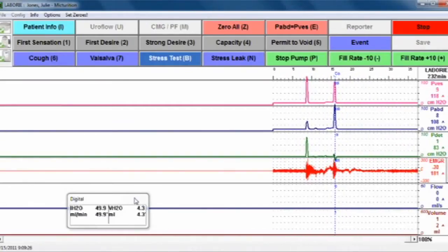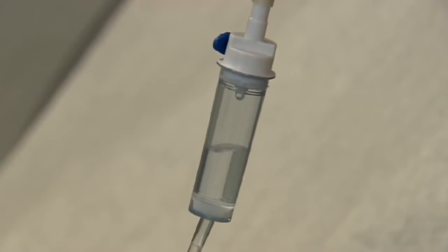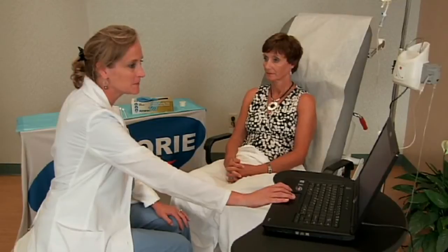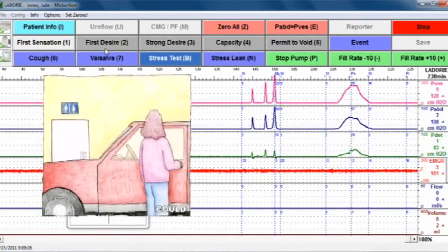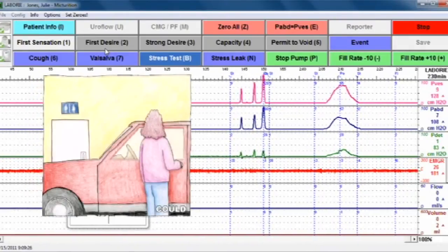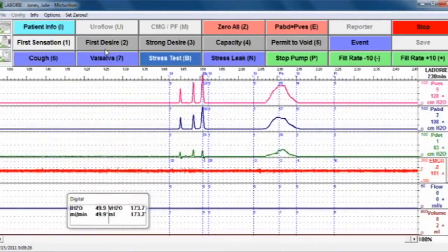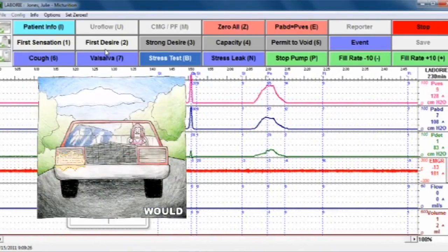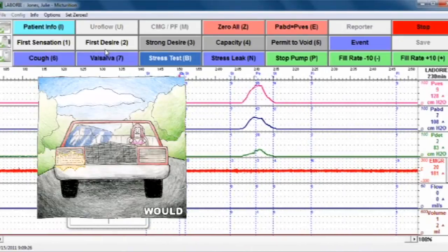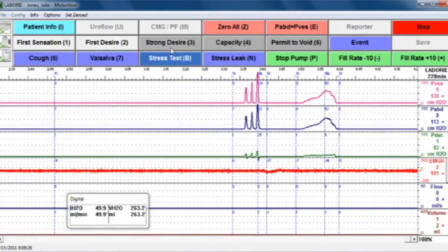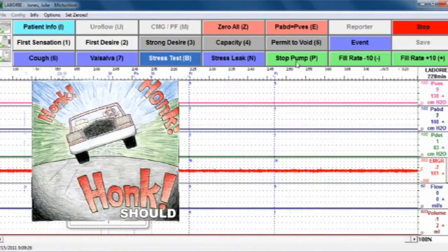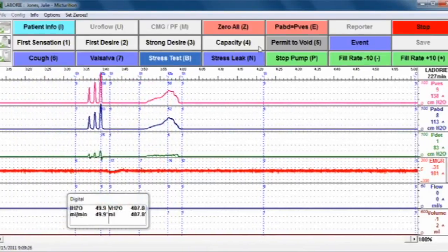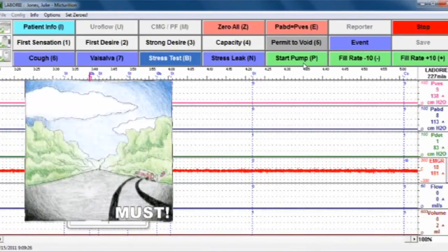Confirm that the fluid is infusing freely by looking at the chamber on the IV tubing. You'll explain to the patient that you want them to tell you when they have their first sensation. First sensation is when the patient has the first sensation that they could empty their bladder. First desire is when the patient would go to the bathroom if it were readily available. Strong desire is when the patient should empty their bladder due to increased sensation to do so.